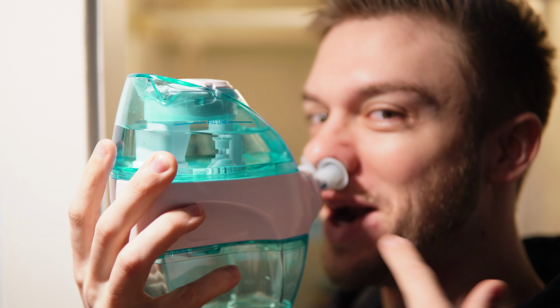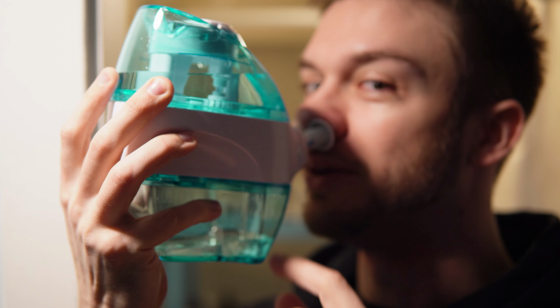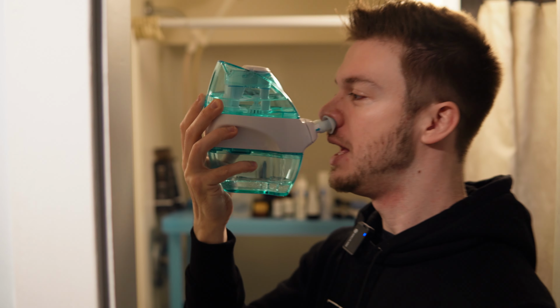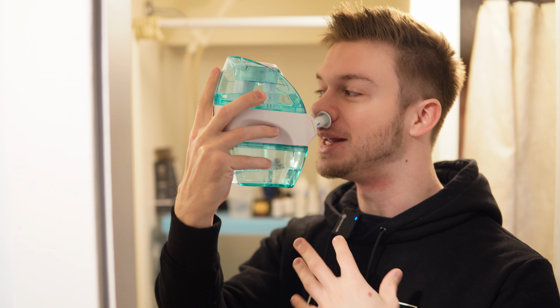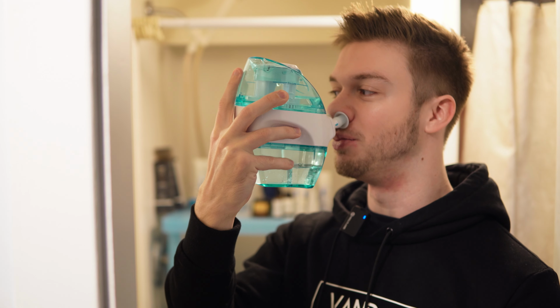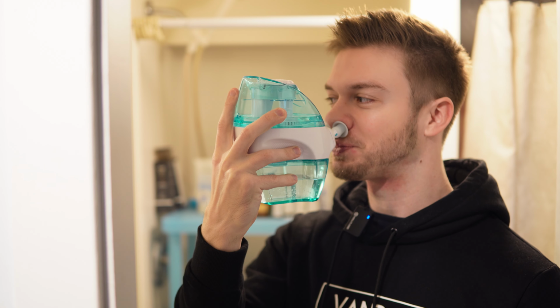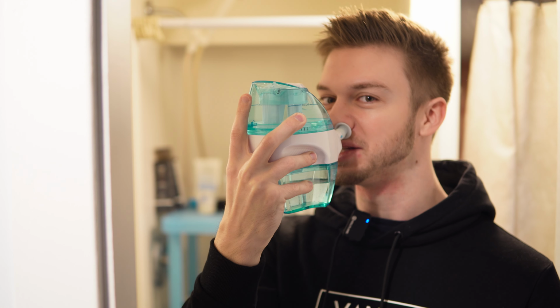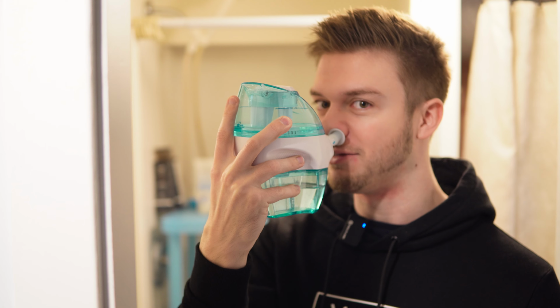Now it's shooting water through. It's a very weird sensation, but you'll see it start to come out into the bottom there. And yeah, you just let it do its thing. To the best of your ability, try to keep the back of your throat closed and it'll suction everything through properly. But yeah, this does take a couple of minutes to go through and clean, so bear with it. It's kind of uncomfortable, but you'll feel a whole lot better after this is done.